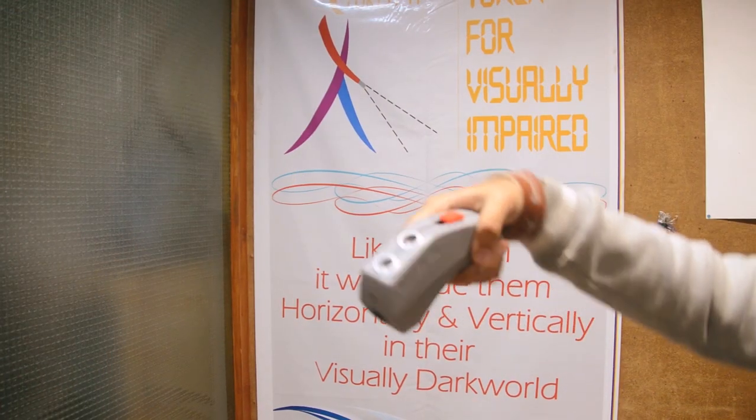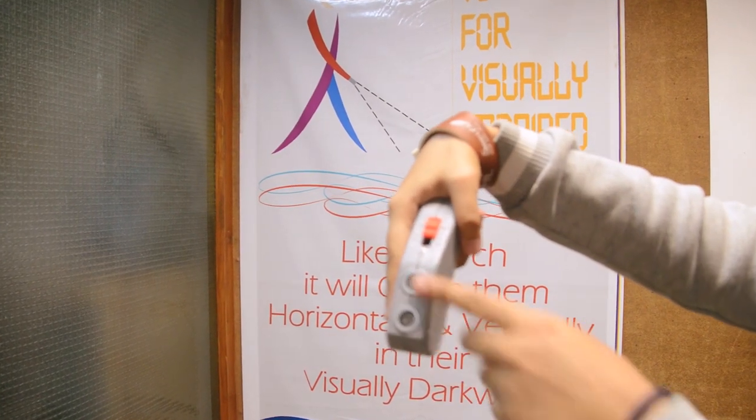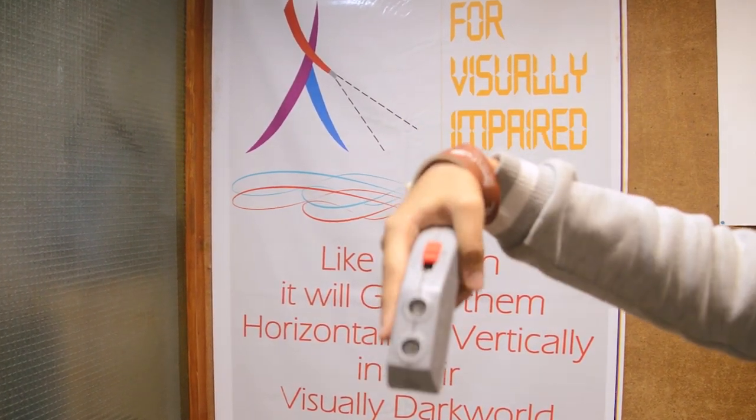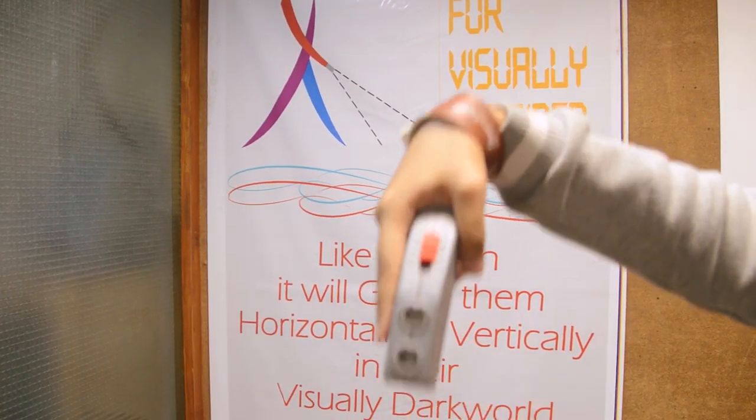As you can see, there are two circles at the top — those are the sensors of this device. This device is to be held in such a manner that these two sensors are facing the front.